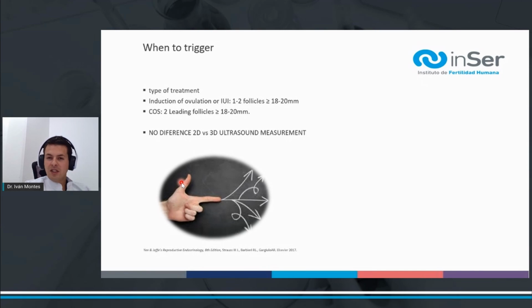There is a question that arises for all clinicians who perform the ultrasound, especially at a technical level. When we have a follicle with a circular shape, the diameter is easy to calculate because you just can trace it in any way. However, in patients where, due to the position of the ovary or the pressure that you generate during the exam, the shape of the follicle is oval, the way to calculate it is through the following equation.